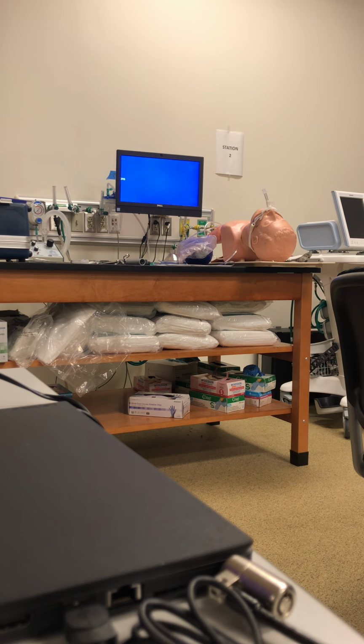So for an adult, we usually do 8s across the board. If you're orally intubating, we do 8s across the board. Rarely have I seen a 9, okay? And you need at least an 8 size ET tube if you're gonna bronch a patient. Okay, if you have a very small little old lady who they can't get an 8 in, they might use a 7.5. But mostly adults are an 8. If they're nasally intubating, probably a 7.